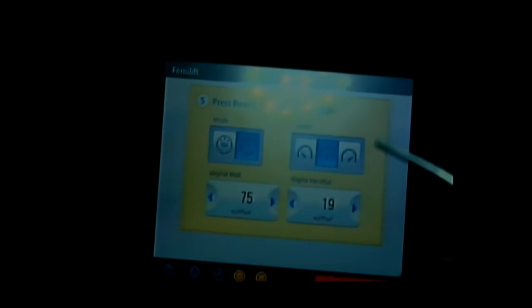And this is the 4th passage, and then will be the last 5th passage. So this is the 4th time we are doing, and then 1 more pass. So we are following the 5 passage protocol here. Personally, I found that the more laser beams that you shoot, the better results that you will have. Don't settle only for 3.